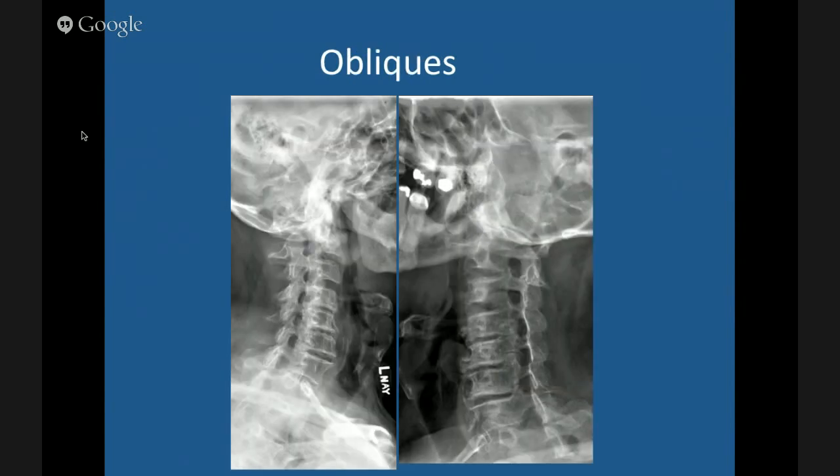For the oblique views, if you look at this film labeled 'left' — it's actually the left side of the patient. If you do the film AP and rotate, it's actually the right cervical foramen you're looking at.